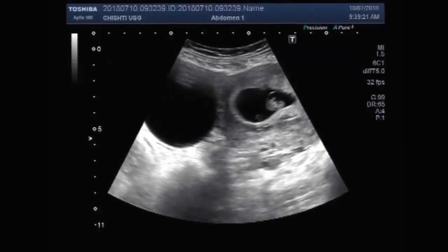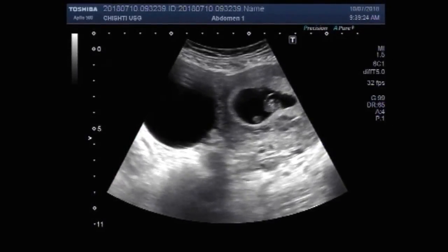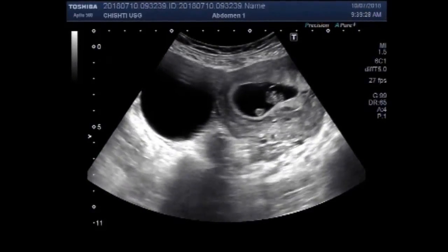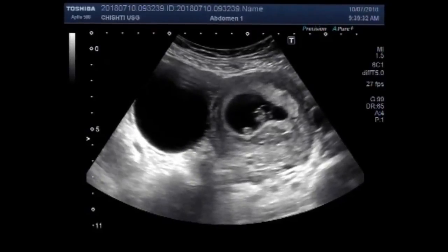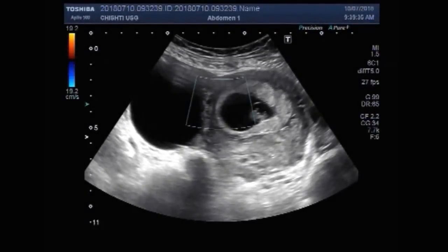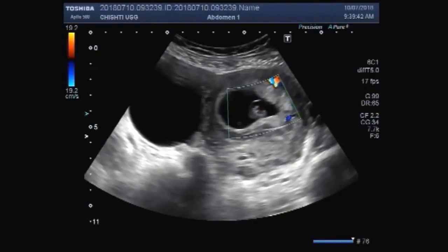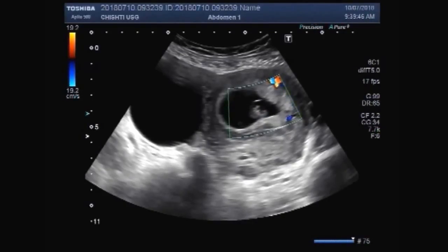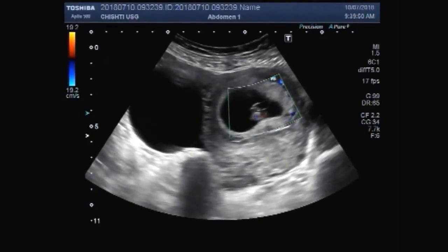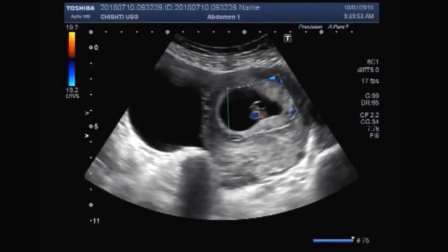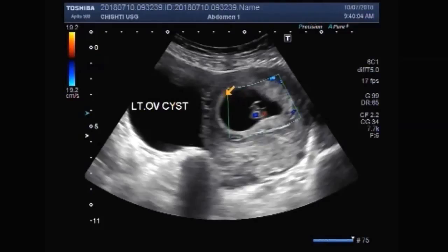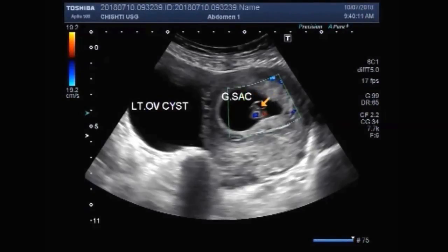Quite a large ovarian cyst. Again, the blood flow is also seen inside the fetus. This one is the left ovary cyst. This is the gestational sac and this one is a small fetus.